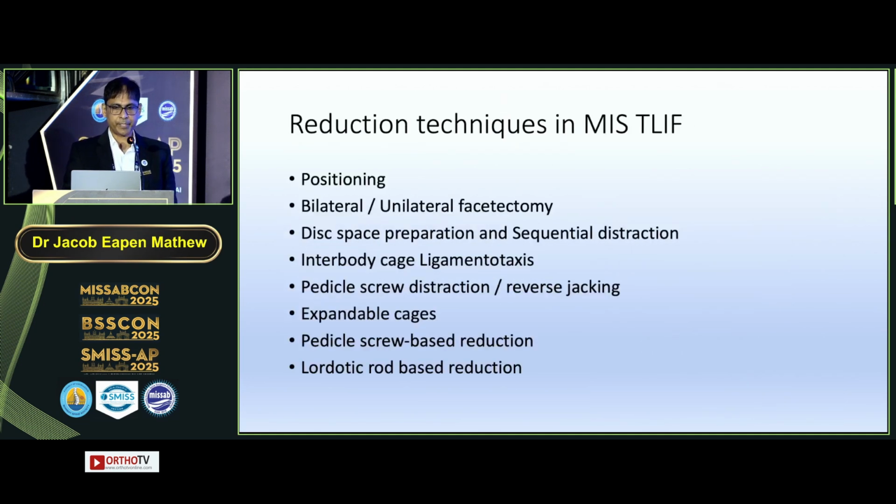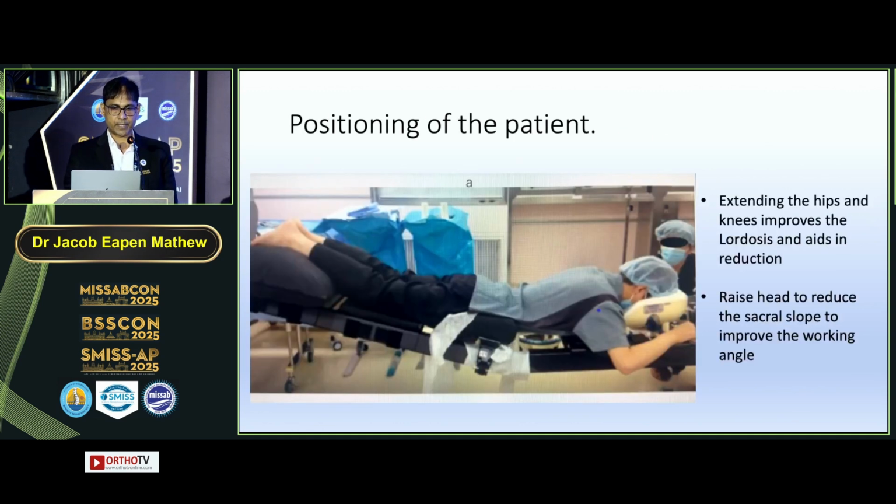So in brief, these are the few techniques which I use: positioning, facetectomies, good disc space preparation and sequential distraction, then pedicle screw distraction and/or reverse jacking, expandable cages, pedicle screw based reduction, and lordotic rod based reduction.